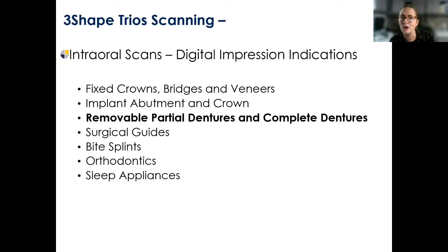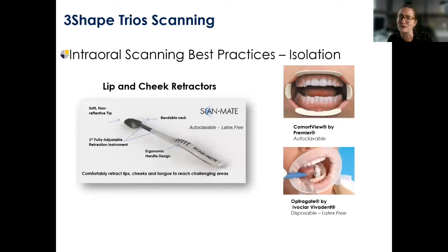I always like this slide because years ago it was fixed crown and orthodontics, and that was about the only two things you could scan for. And every year something else is added. The technology has evolved tremendously, especially just in the last 2 to 3 years. So we're really excited to share some, hopefully, new techniques for you tonight.